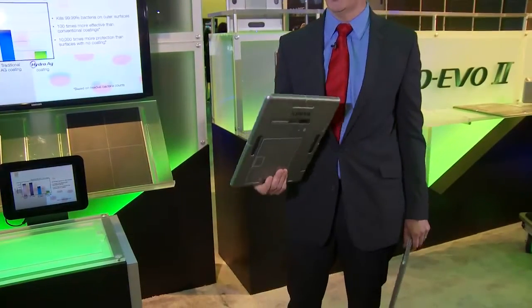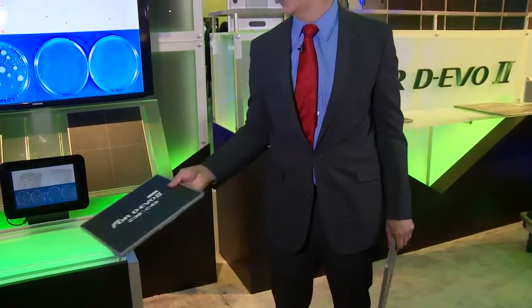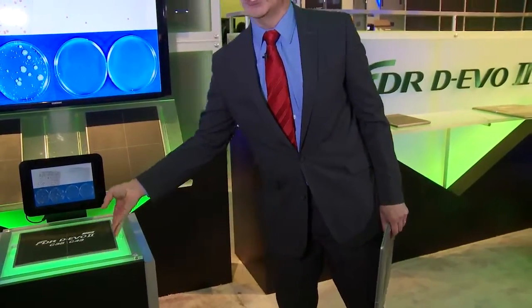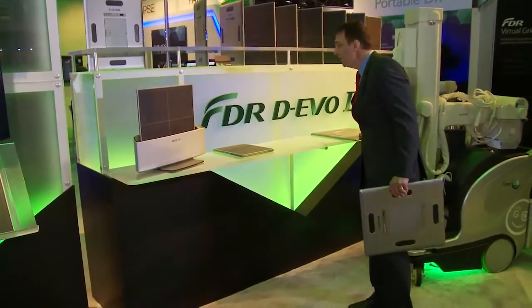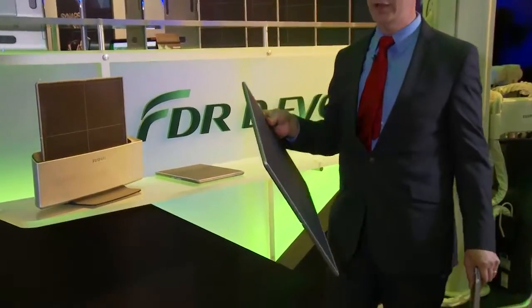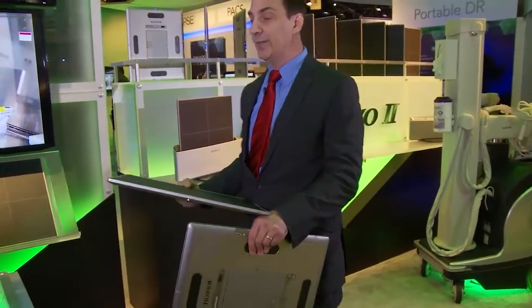The 24 by 30 is a nice small format that fits in every neonatal isolette and is perfect for all kinds of cross-table imaging and small format exams. In addition to those two sizes, we have our full 17 by 17 size in a portable detector. All these detectors are very lightweight and all use the same batteries.